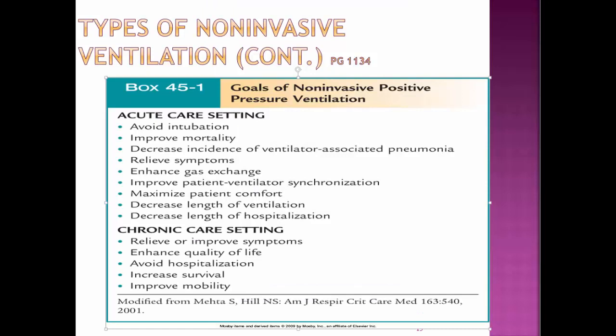This is box 45-1 on page 1134 of your text. Goals of non-invasive positive pressure ventilation. Maybe the number one goal is to avoid intubation. Improve mortality, decrease the incidence of VAP.